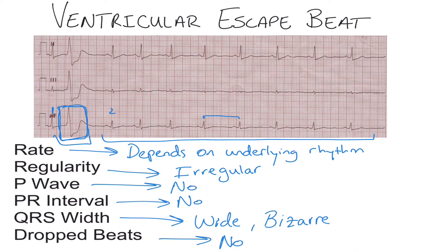With a ventricular escape beat, it is a non-compensatory pause, meaning the ventricles actually reset their timing cycle after the wide bizarre beat. If we measure the distance from QRS one to QRS two, it should be roughly nine to ten boxes away. However, when we march them out, we find they're just under eight boxes. So we can say with certainty this is a ventricular escape beat because we're seeing a non-compensatory pause. If we saw a compensatory pause, we would call this a PVC.